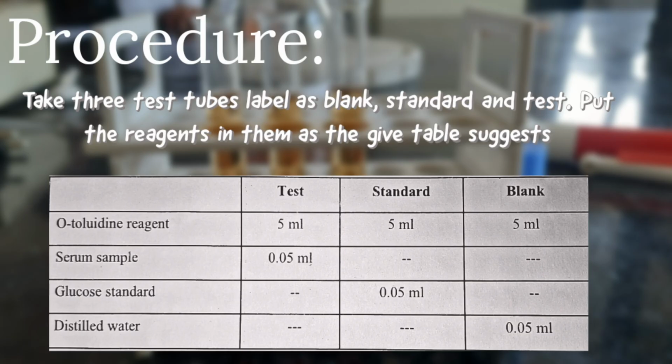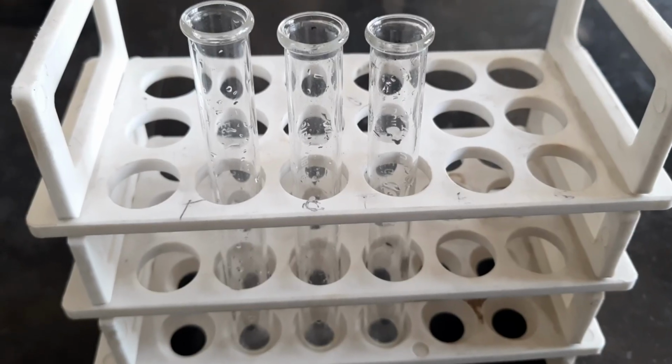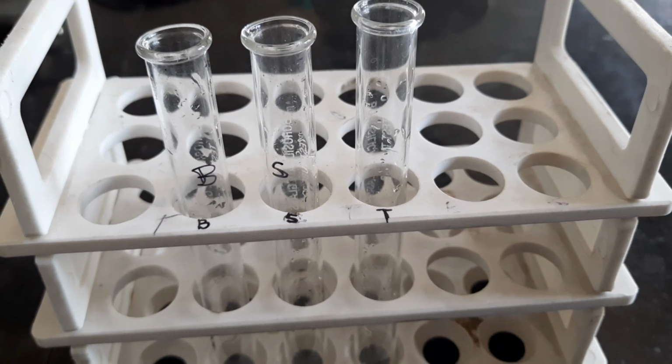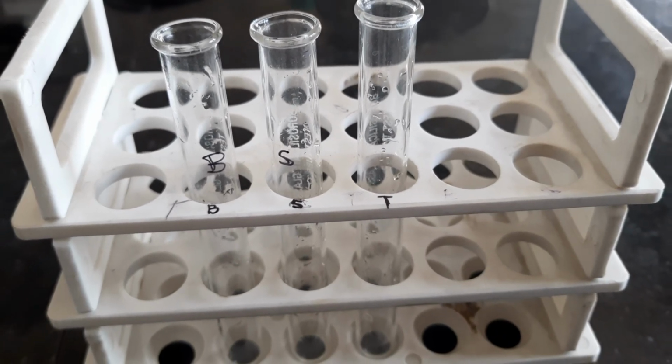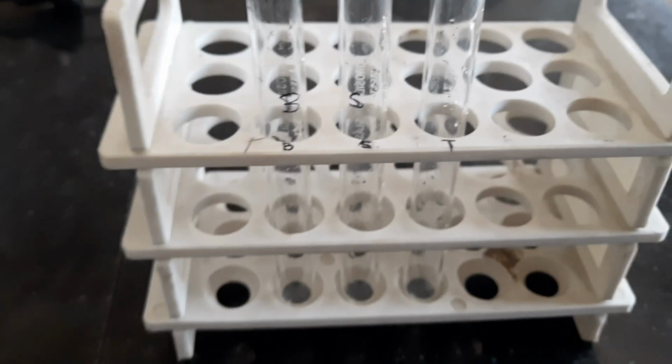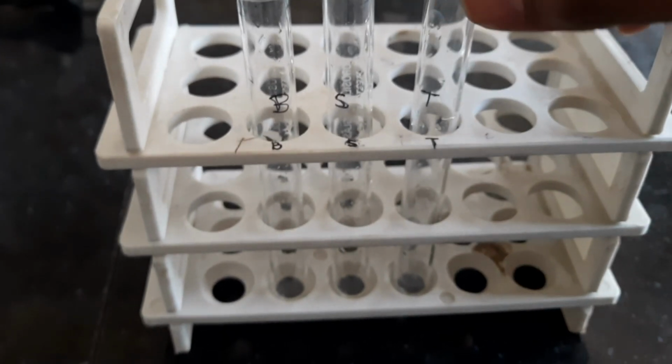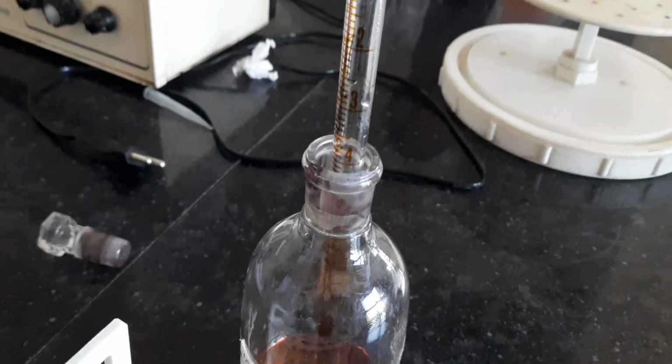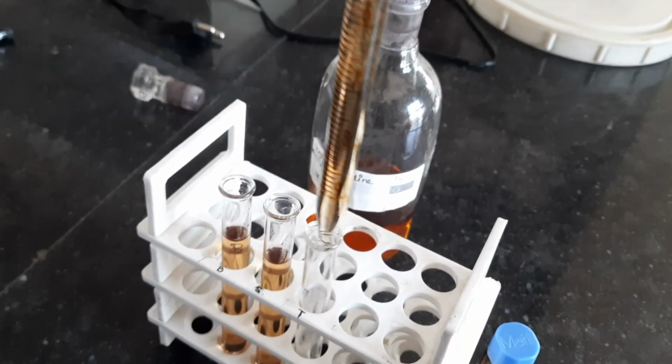For the procedure, take 3 test tubes, label them as blank, standard and test, and put the reagents in them as the given table suggests. So, as per the protocol, we have taken 3 test tubes and labeled them as blank, standard and test. After that, as the table suggests, we will be taking 5 ml of the O-toluidine reagent and putting it into each of the test tubes.